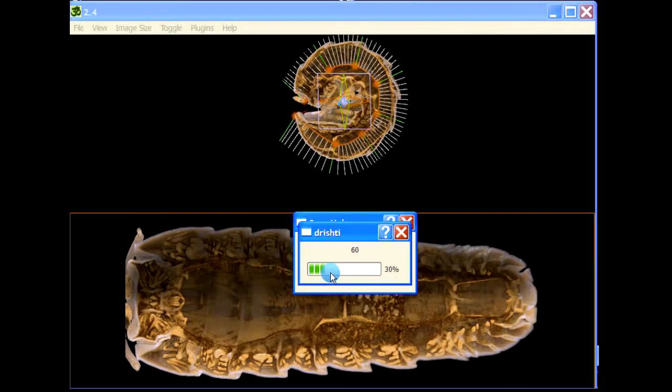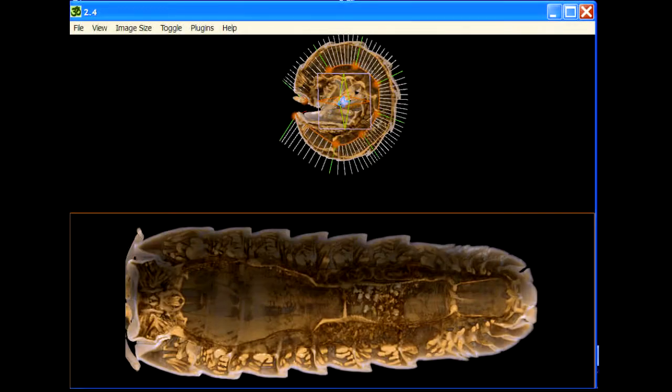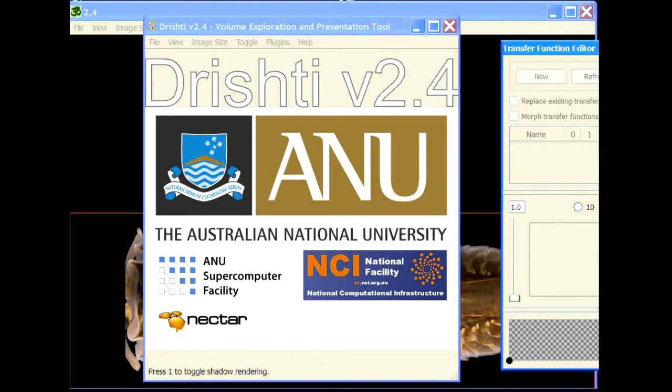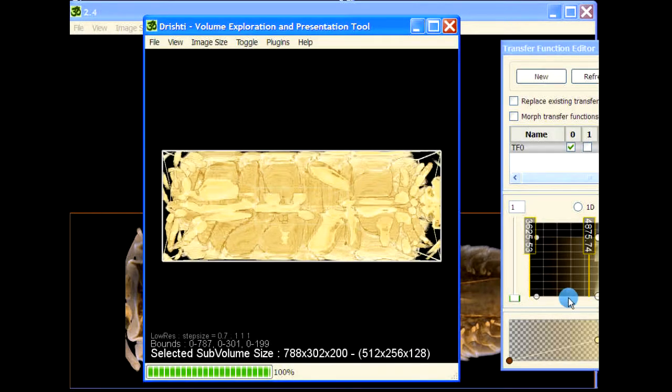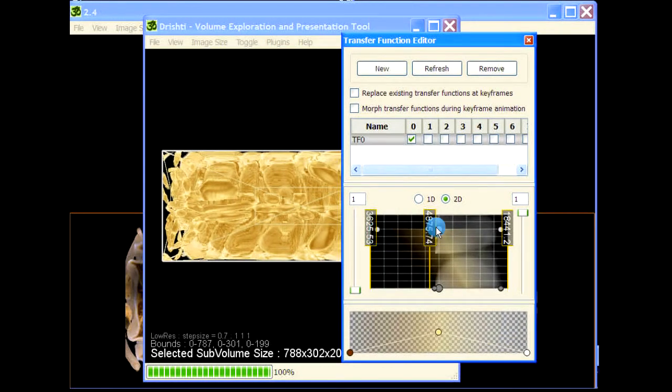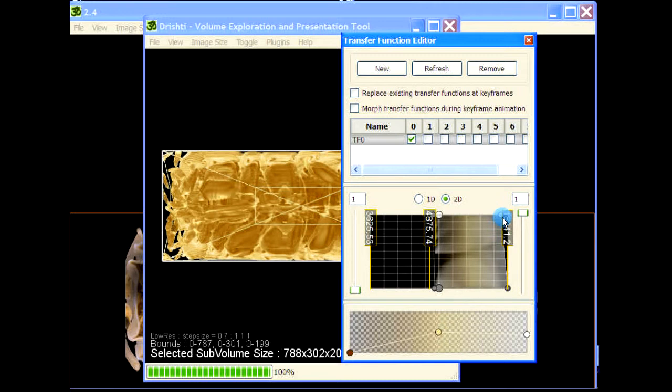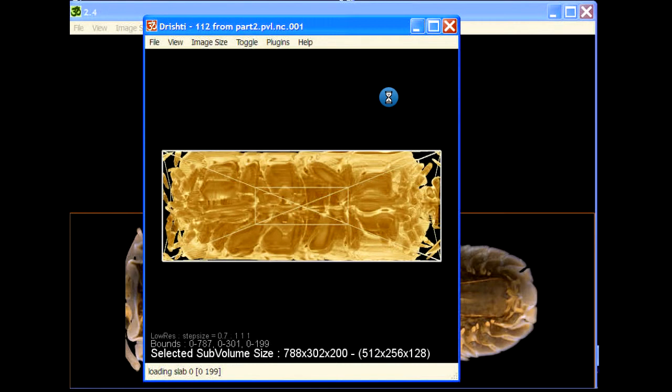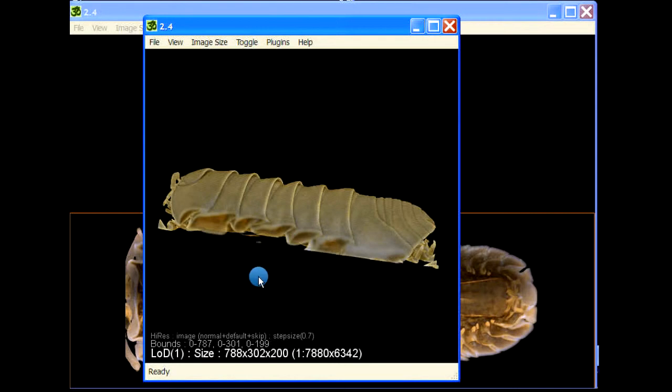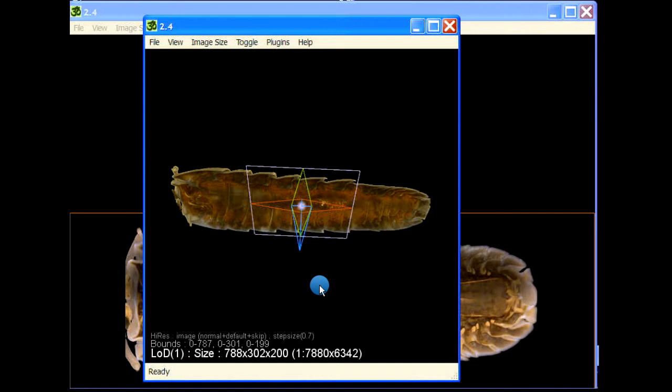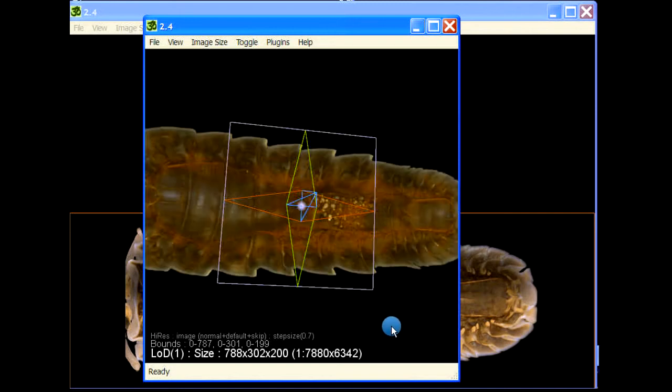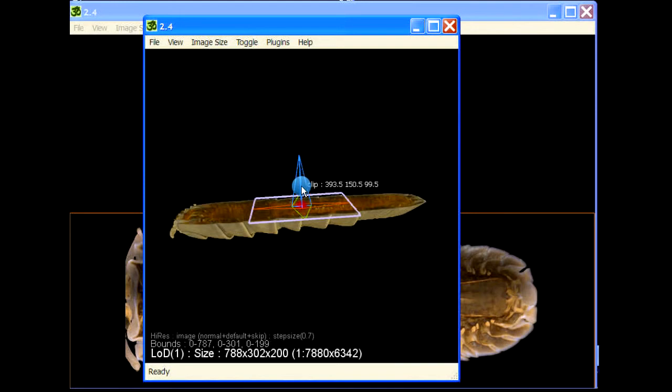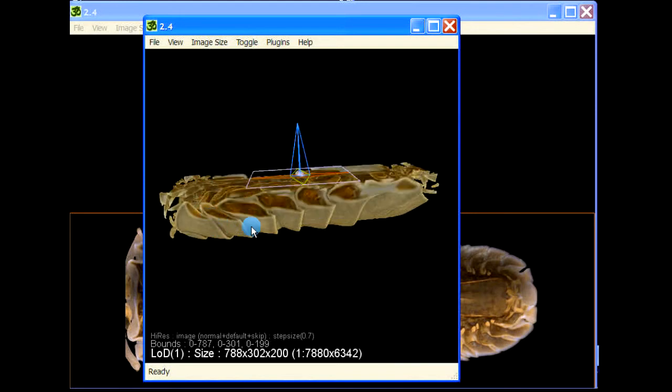Again CMS value, okay. Let us fire another instance of Drishti and load part two here. This is part two. Let us tweak the transfer function to show what we have saved. This is what we have saved here. Now if we put a clipping plane, then you will see that this is basically part one here. Half of this volume is part one.